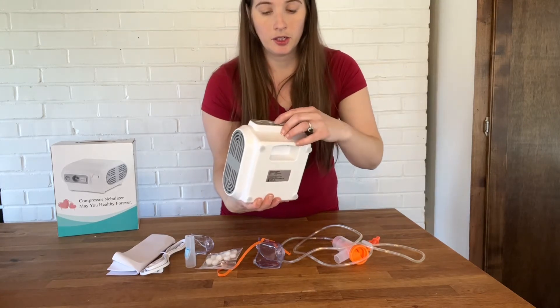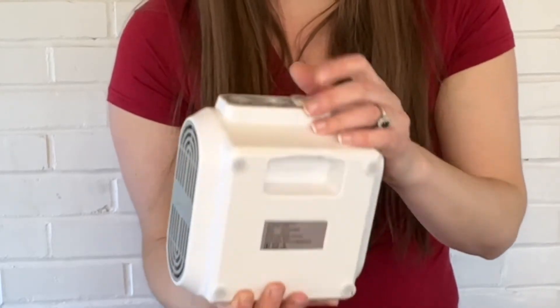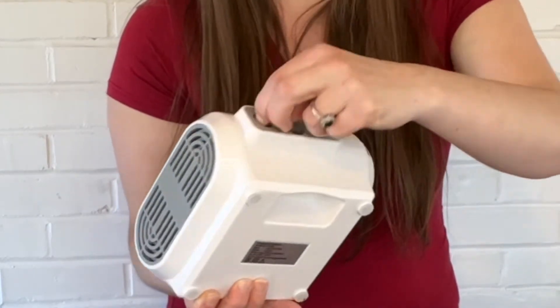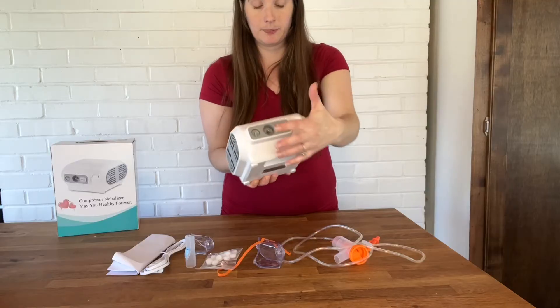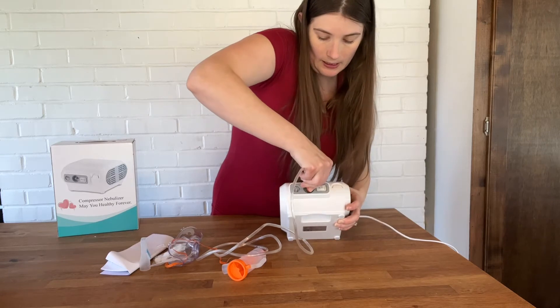Notice on the front you have your power on and off button. You have where you plug in your cabling, and this is where you control the atomization right there. Plug in your tubing right in the front.